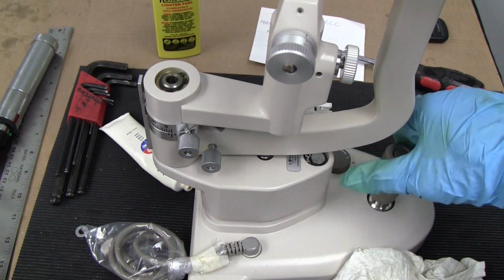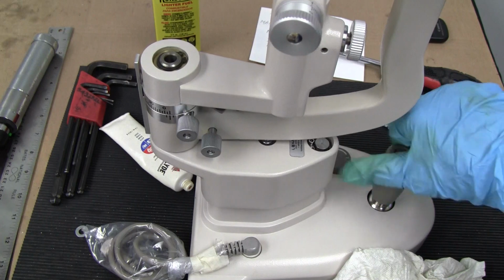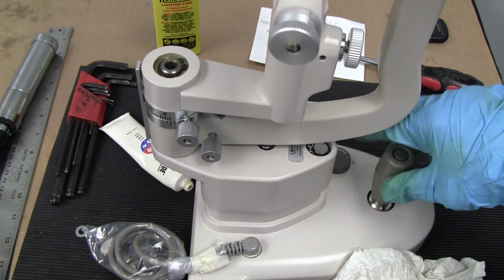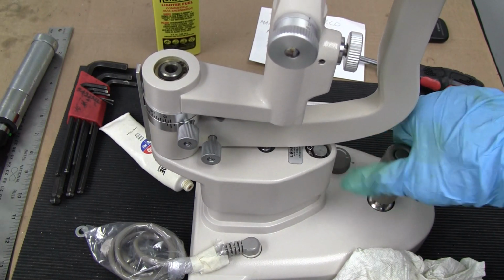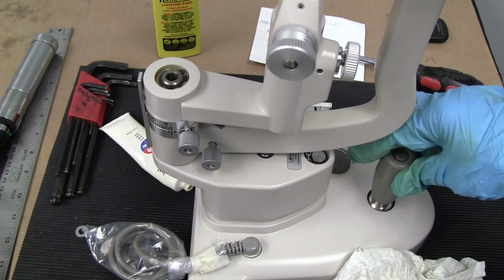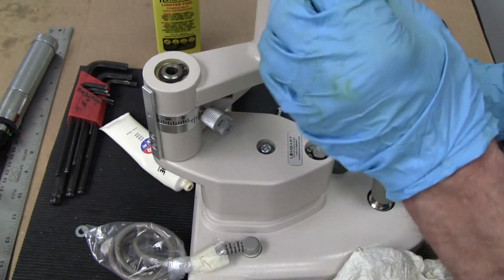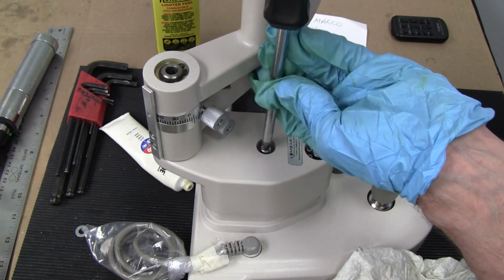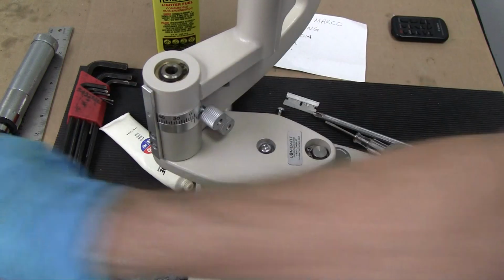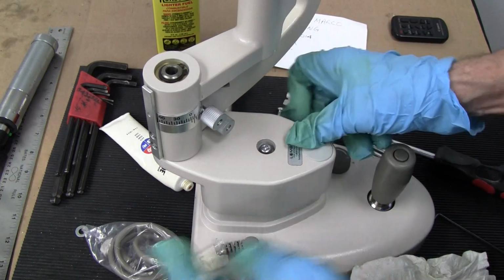It should be a little harder going down than up, because now you have a stronger spring, and it's okay. It'll slowly start leveling out. So if it's easier going up than going down, that means your spring is doing its job, because a brand new spring will be really strong. If everything is moving fine, you might want to check, make sure everything is tight. With your lock washer on there, that shouldn't come loose anymore. Make sure these are tight. And put your caps back on.